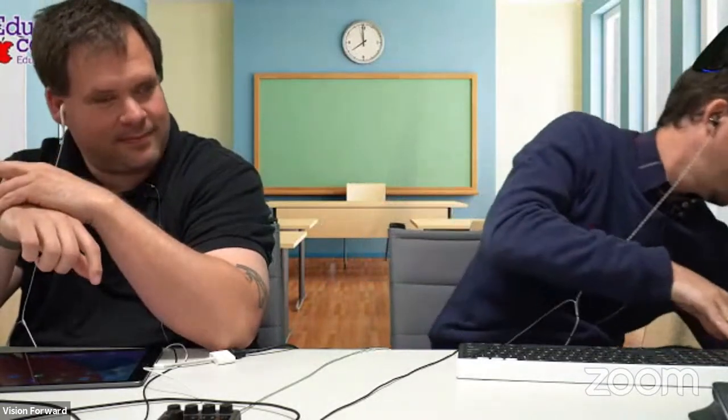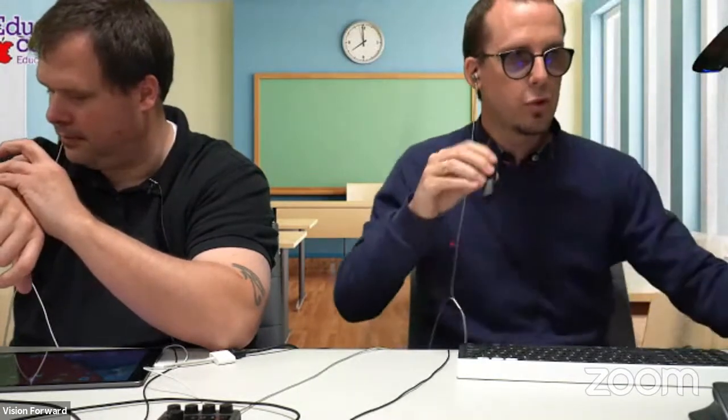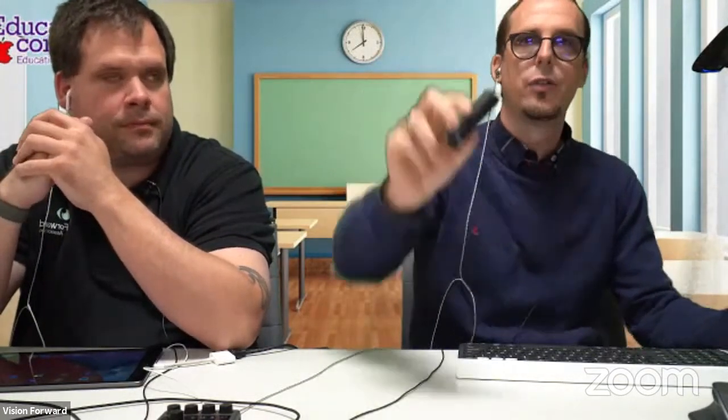But I will quickly show this device here, which is the Orcam. There's a few different models of these. Actually, they made it very confusing because there's almost infinite models because you can basically configure this how you want it now. Let me say what it is first. This is ultimately an optical character recognition OCR device. So it reads printed text aloud to us, similar to what we were just looking at with the Connect 12. That's what it's best at.